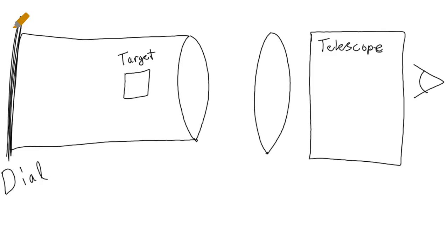So now let's go into lensometry. I'm going to take this to the whiteboard to help us understand that topic a little more thoroughly. You already have this picture in your text, so you don't necessarily have to draw everything out, but I wanted to break down a lensometer so you understand what's going on with lensometry, because it will help us address an optics question that comes up that we don't think about in clinic, but makes for a good optics question as we're going forward.